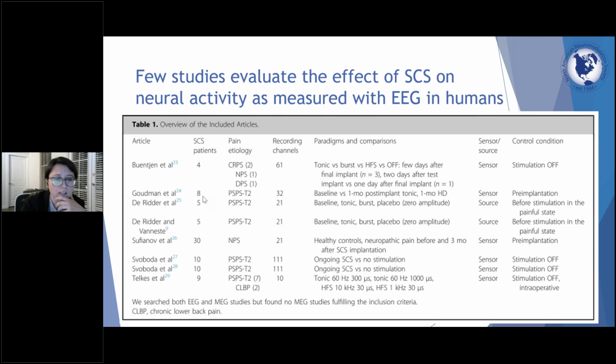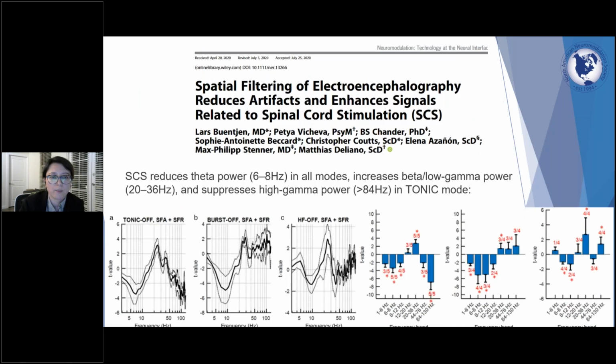And these studies are all published in the last decade or so and investigate the spectral features in response to different spinal cord stimulation waveforms. Let's briefly look at the major findings in these studies. The first one from the table is a 2020 study. In this study, researchers investigated the spectral effects of tonic, burst, and high-frequency stimulation at 1.2 kilohertz.